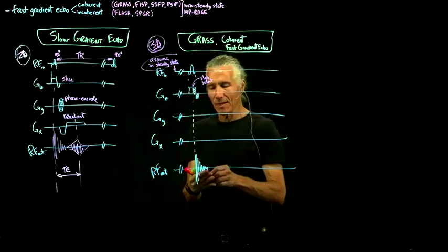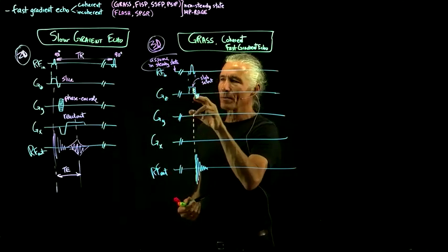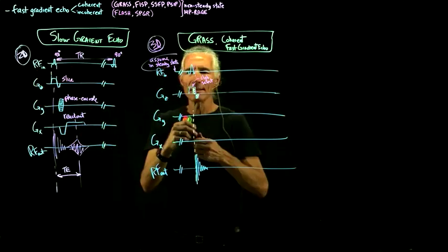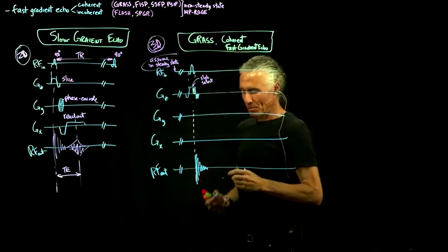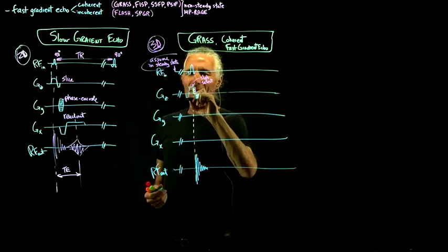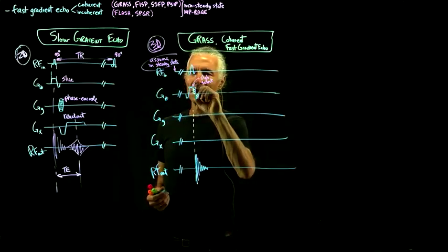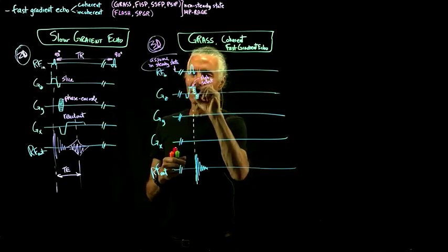But the problem now is that there's already some magnetization there before we started, because previously, like in this case, we were assuming there's nothing here. And since there's already something there, we have to sort of pre-break things that this part is going to break. And then we add more RF, and then we post-unbreak things that we broke in this second half.